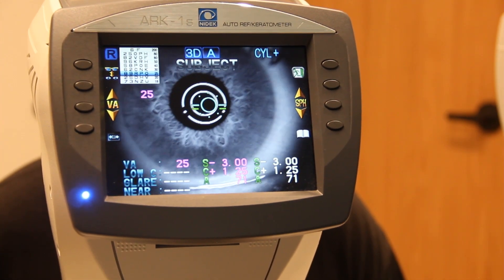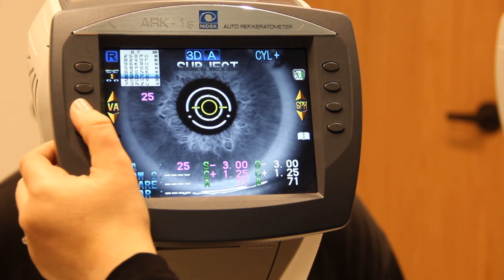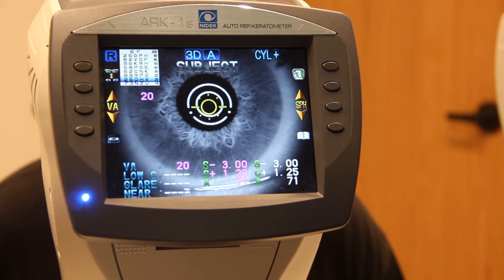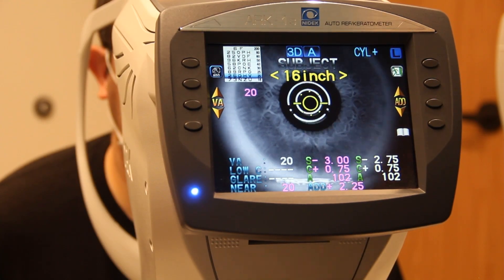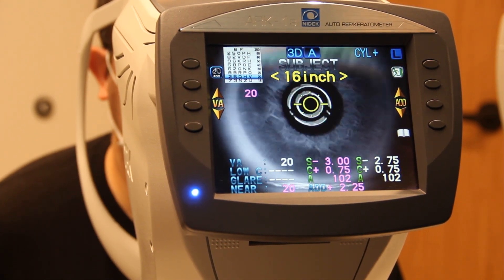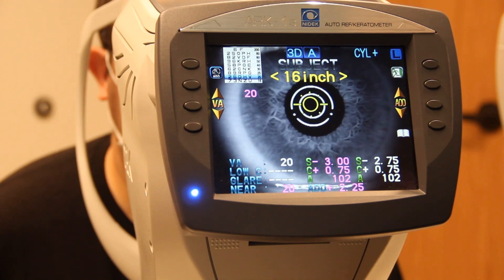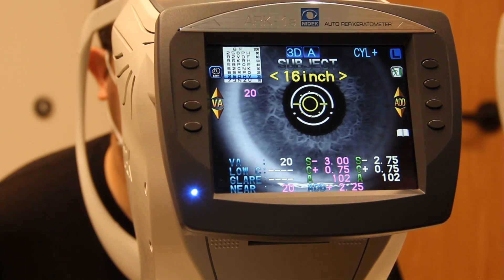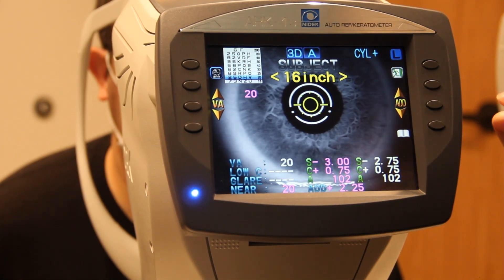On the other eye: eight, nine, R, P, O. If you're worried about the veteran having memorized the letters, you can ask them to read backwards so memory doesn't trigger. Two, five, D, H, V — perfect. Now, if your veteran complains of glare — say they have a hard time driving at night, or their best corrected vision is 20/30 or worse — you want to check glare. Your reading doctors may have different guidelines, but that's a good rule.